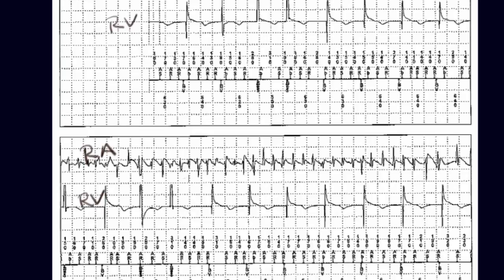Atrial fibrillation — yes, exactly. So why do I say this? Because you see how every electrical signal on the atria has a different voltage, a different shape, different intervals, and so on. This is definitely atrial fibrillation, and that is how we diagnose it when we look at devices.